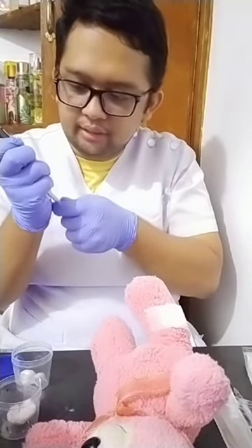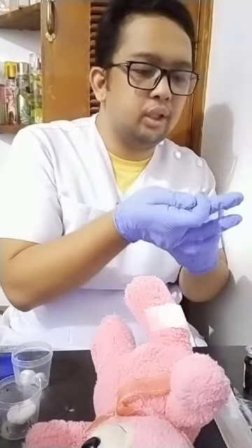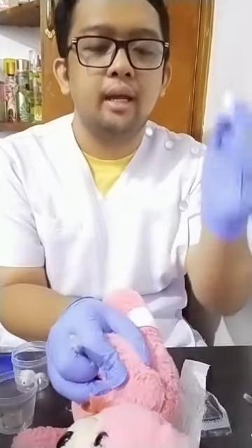So after re-aspirating, use a separate new needle for it not to be blunt, especially for the pedia patient. Then usually it is still the subcutaneous tissue of the thigh or the upper outer quadrant of the triceps area. Clean, inner to outer circularly, pinch slightly, 45 degrees, inject to the subcutaneous fat.